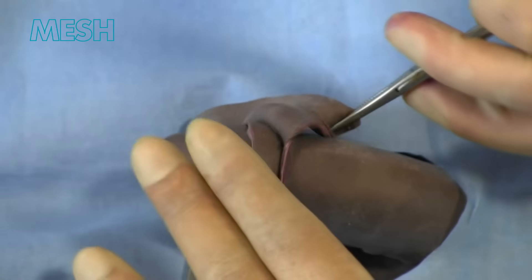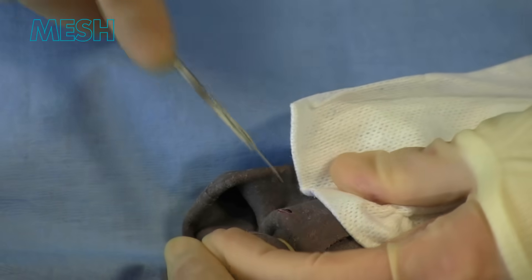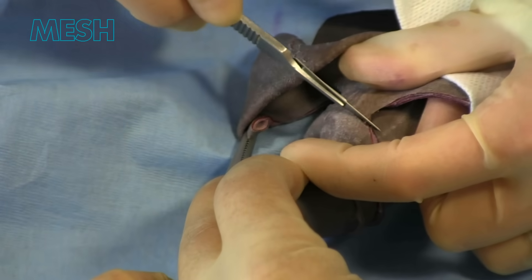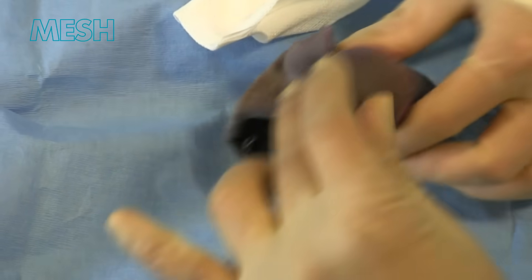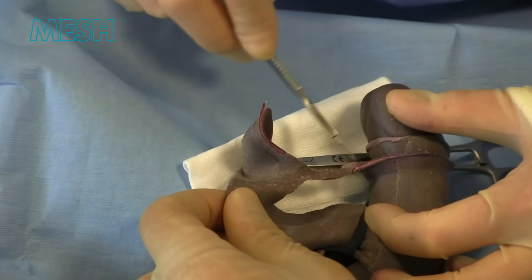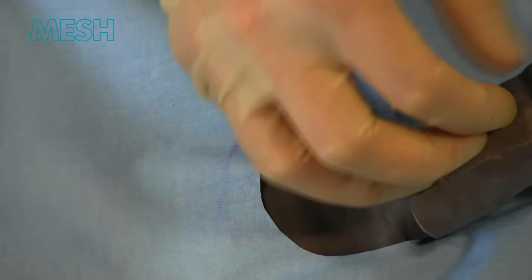This can be performed with your blade or indeed bipolar scissors. As we know, most circumcisions are performed for balanitis xerotica obliterans, and it is vitally important to check that the meatus is healthy.